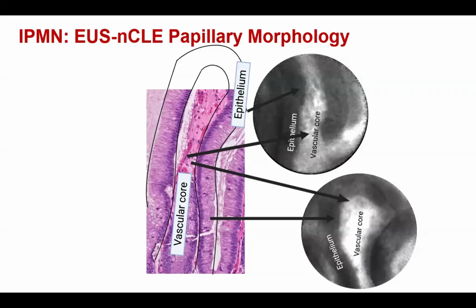And interestingly, in cardiology, they have a transesophageal echocardiogram, which is a three-dimensional probe. Essentially, the probe diameter is not bigger than what we have, but computationally, it gives you a three-dimensional rendering. And I'm surprised that we don't have one in GI. And for the industry people up in the back, this is something to really innovate. It will help us quite a bit.